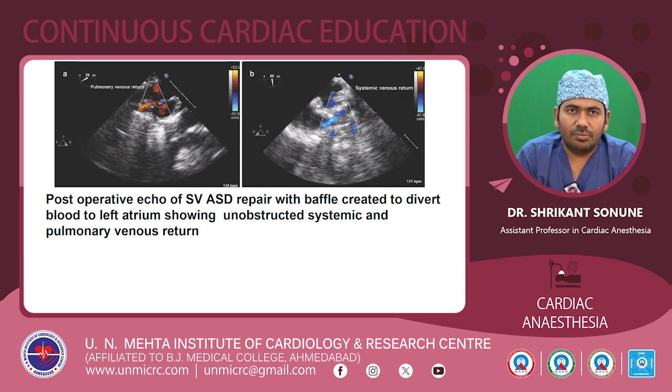This is an echo image of a patient who has undergone sinus venosus ASD repair. The baffle created to divert the blood to the left atrium shows unobstructed systemic as well as pulmonary venous return.